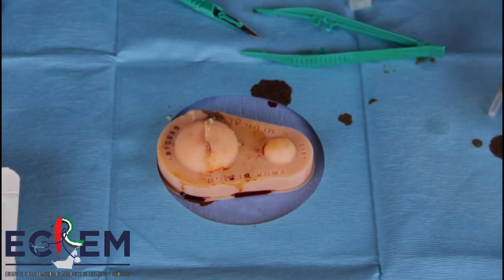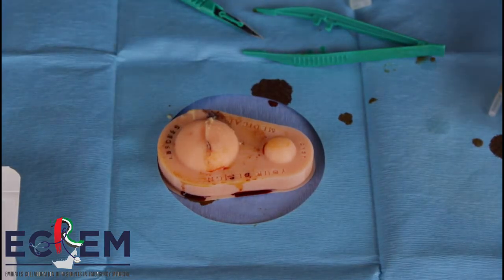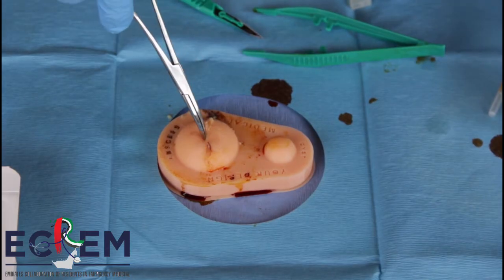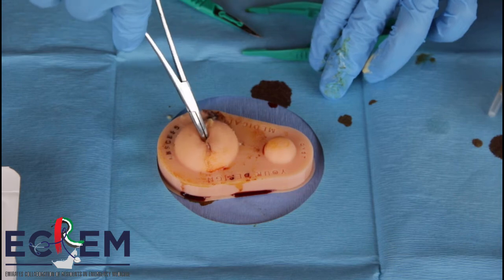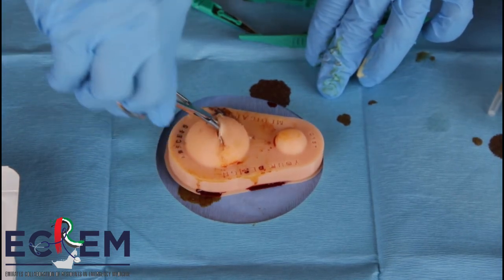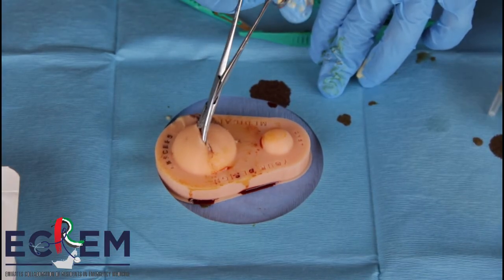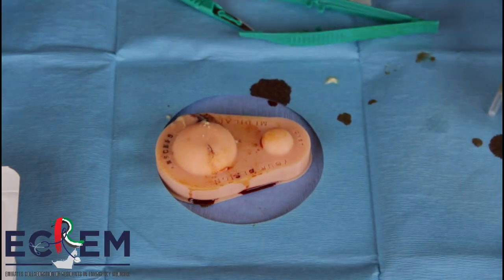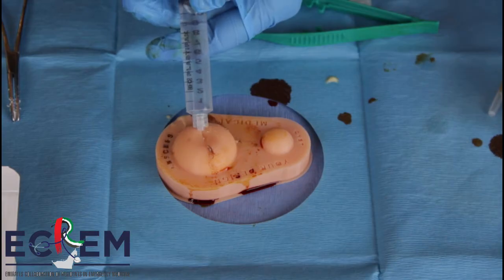Next, we will be using the artery forceps to remove the septations. We go close. Next, we will be cleaning with saline.